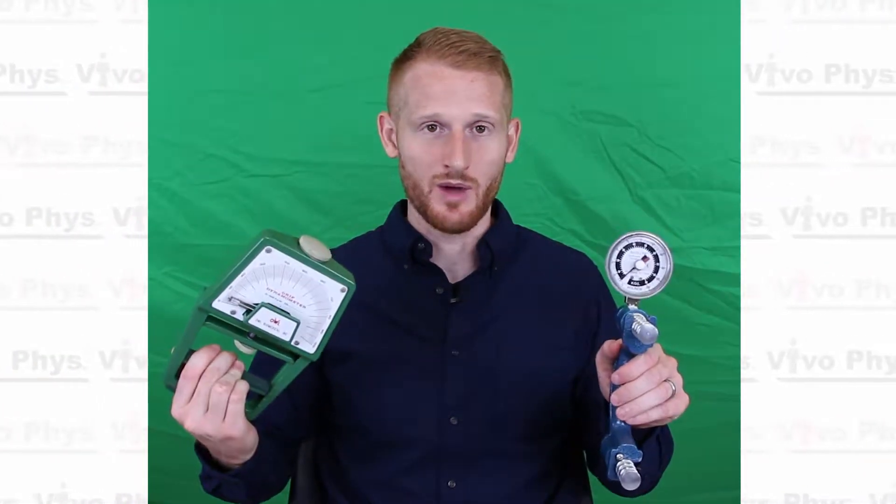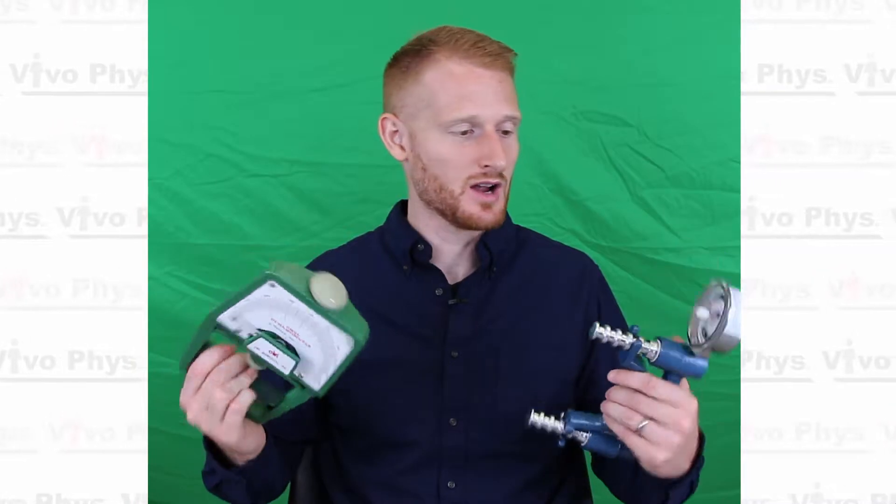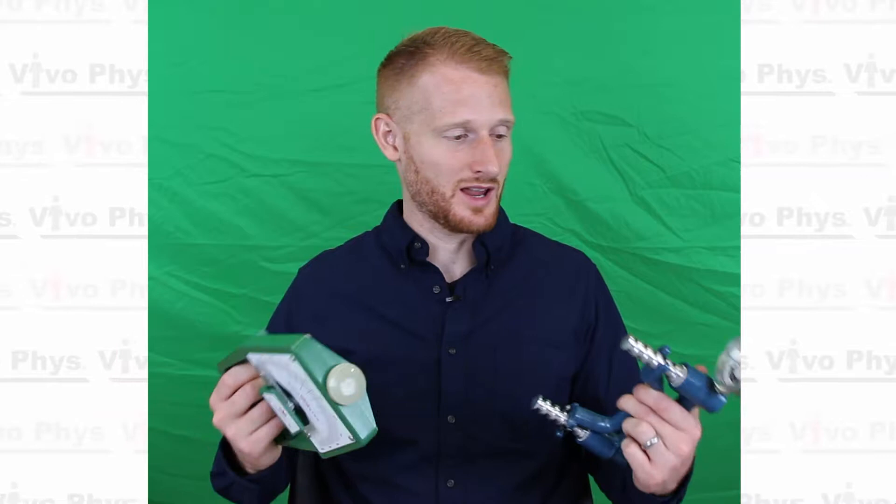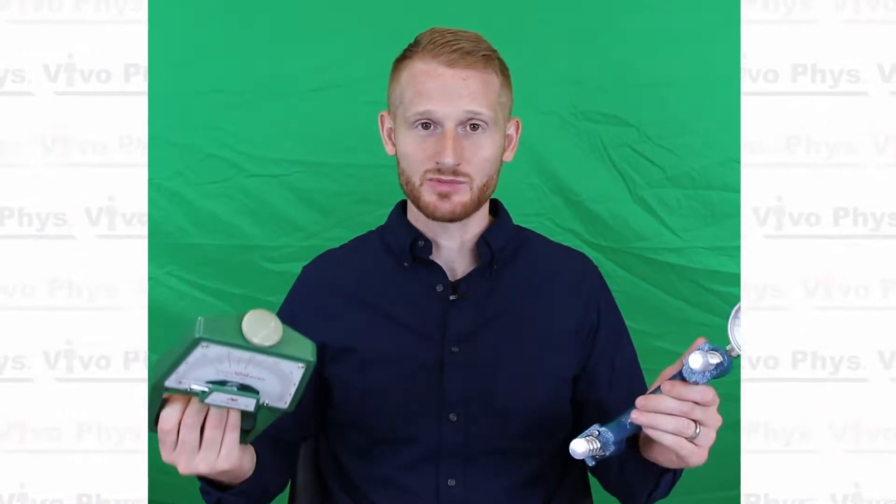Hi, I'm Dr. Edward Matthews. I'm here at the exercise science lab at Montclair State University to show you how to use hand grip dynamometers. I have two different varieties here that work fairly similar to each other, and they are both very good. Hand grip dynamometers in general are good for giving you hand grip strength.